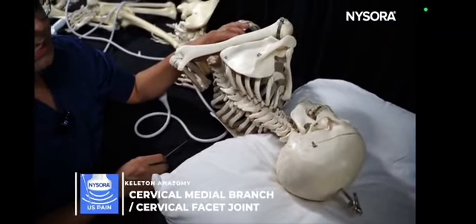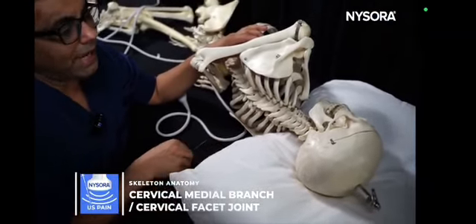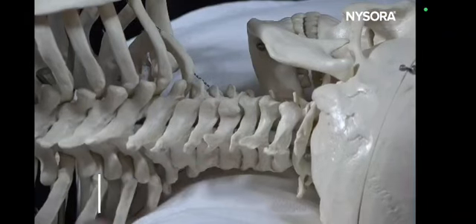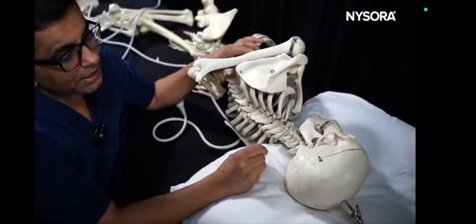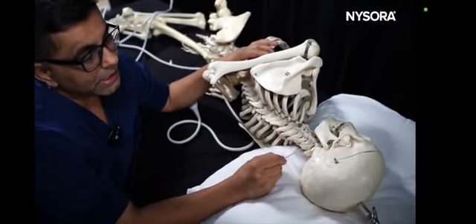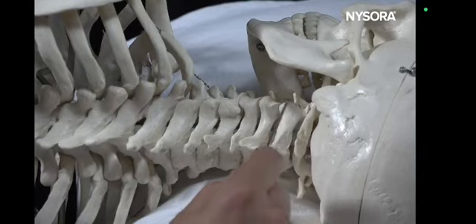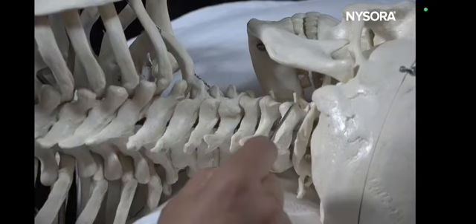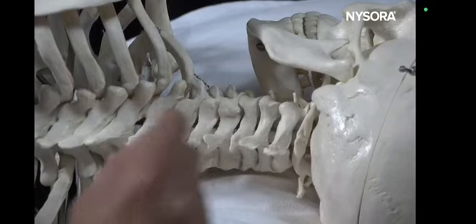So we're going to talk about the skeletal anatomy relevant to the cervical medial branches and the cervical facet joint injection. When we talk about the ultrasound guidance for the cervical medial branches or the cervical facet joints, the reason you want to consider skeletal anatomy is very important. Why? Because you're looking at the bony silhouette on the ultrasound.